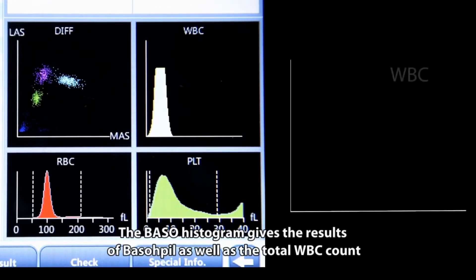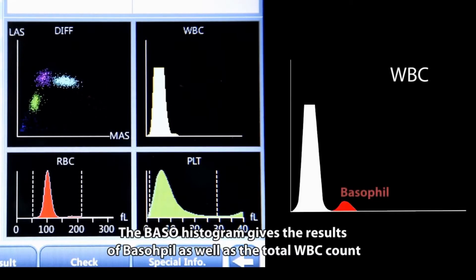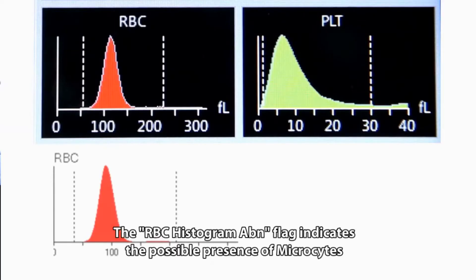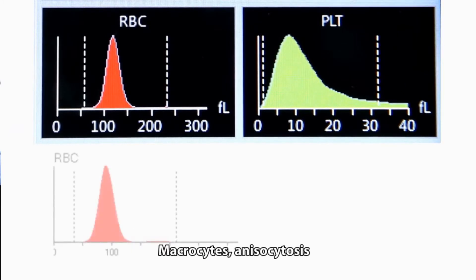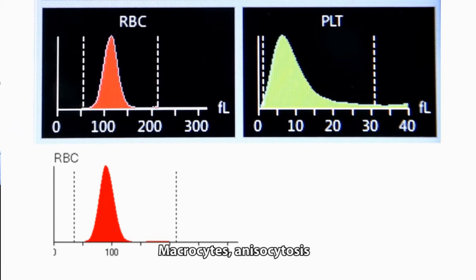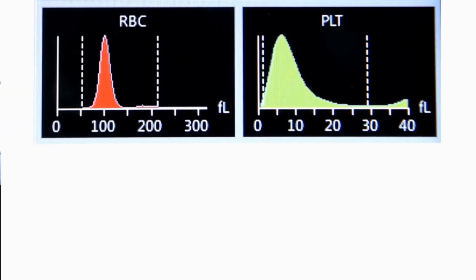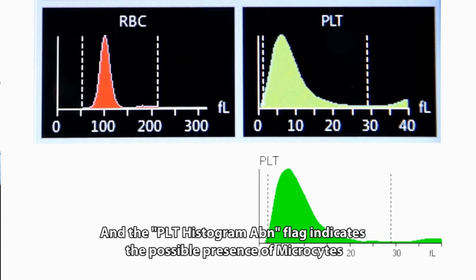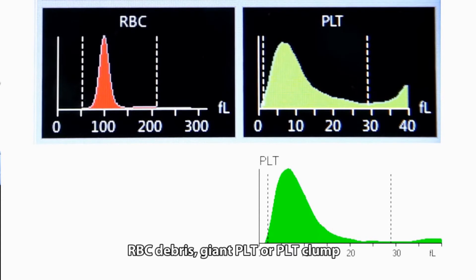The baso histogram gives results for basophils as well as the total WBC count. The RBC histogram ABN flag indicates the possible presence of microcytes, macrocytes, anisocytosis, RBC agglutination, or a dimorphic histogram. The PLT histogram ABN flag indicates the possible presence of microcytes, RBC debris, giant PLT, or PLT clump.